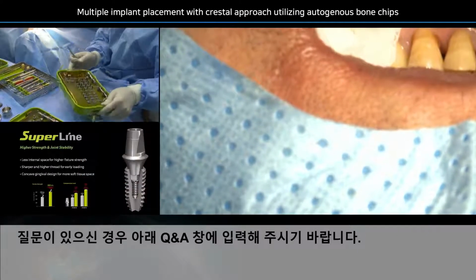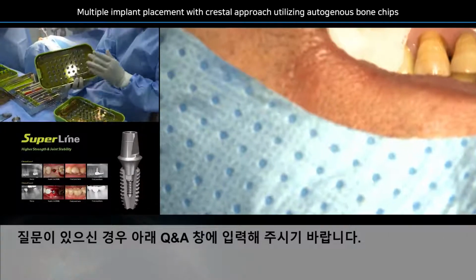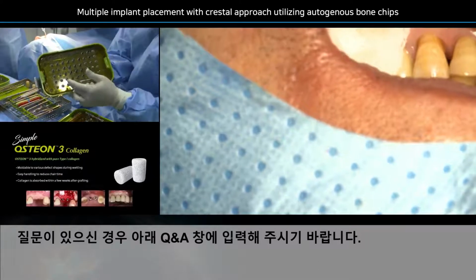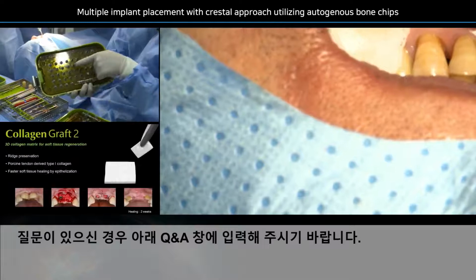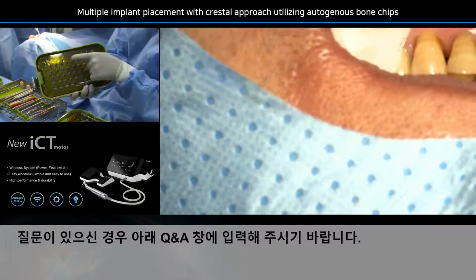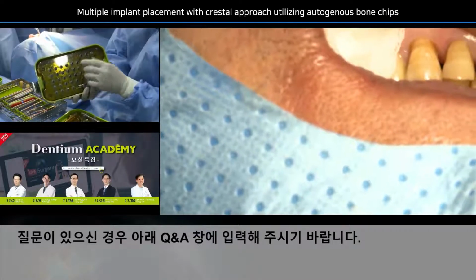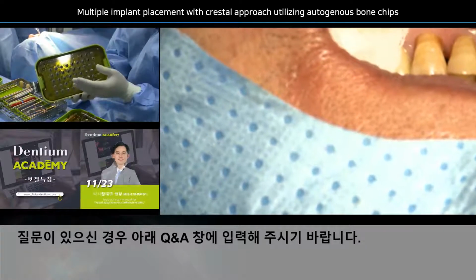But recently, Dentium has introduced the new Dentium drills. This is the drill with the stopper. So instead of these drills, which had 12 drills, now, as you can see, it has 18 drills. They have 8 millimeter, 10 millimeter, and 12 millimeter length, and they start from the Lindemann drill to the final size drill. So a little bit of tricky drills, but if you just follow the stopper, it is quite proof of the accidents.